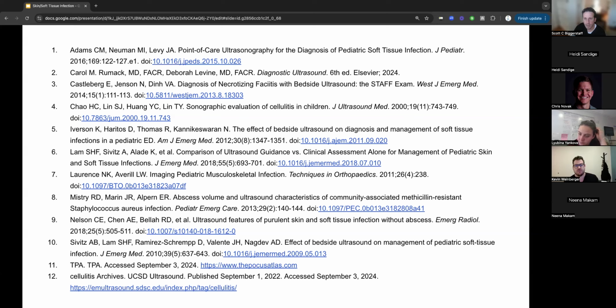I would add something to look for as we talk about ultrasound: things you have to worry about would be post-op seromas in some of our patients. We actually had one this week in a post-op appy who got admitted for concern for cellulitis, got imaging, and it was actually more consistent with a seroma. And I think I presented on one maybe a year ago, Nina, it might be recorded, about a kid who had a concern for a septic joint, got aspirated, and they caused a seroma afterwards. Those tend to be more uniform, but they do look like a pocket of fluid and can very much look like an abscess. That's just something to think about when you're looking at some of these surgical sites or post-op kids, if you do go looking.